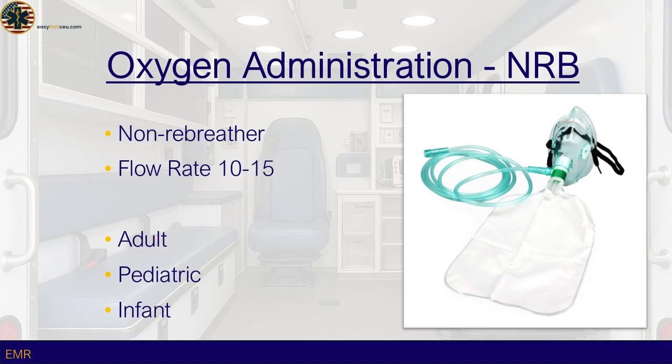However, they are not suitable for apneic or severely hypoventilating patients, as NRBs do not provide ventilatory support. In such cases, EMS providers must transition to bag valve mask, BVM, ventilation or advanced airway management. Additionally, NRBs require careful monitoring, as prolonged high-flow oxygen use may lead to complications such as oxygen toxicity in certain patients, particularly those with chronic obstructive pulmonary disease, COPD.